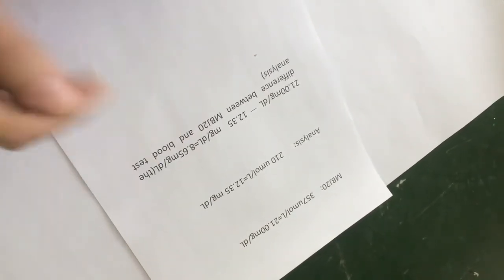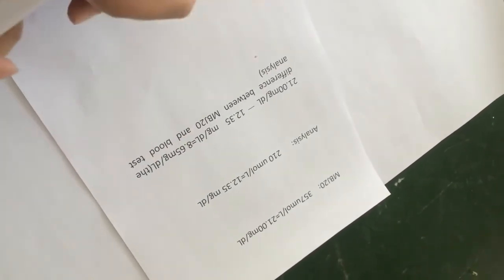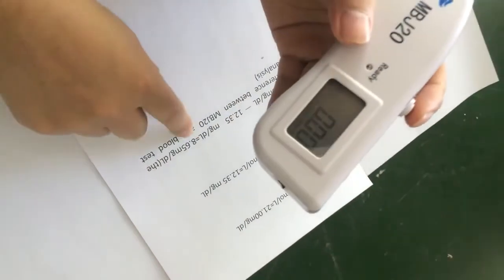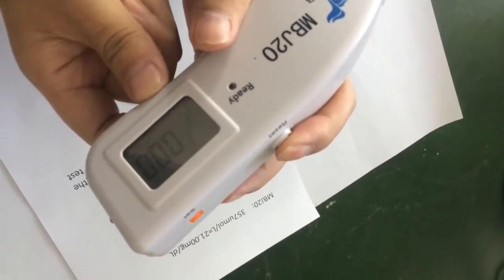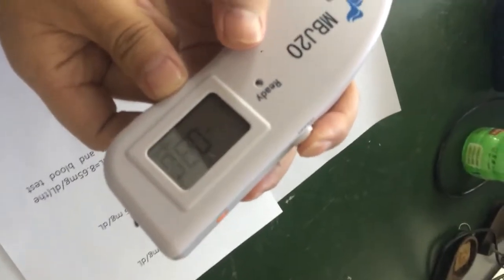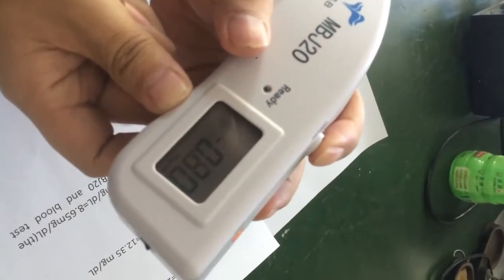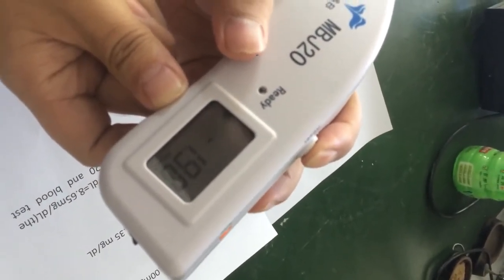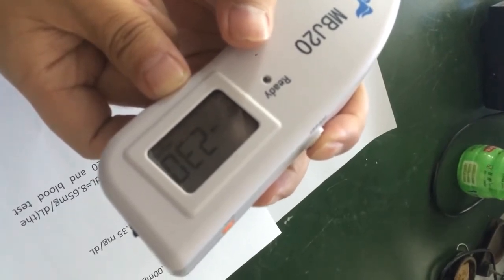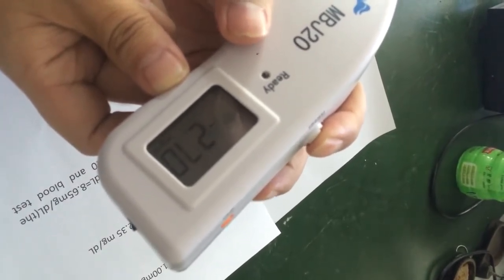This is the number we can work with. This number is higher, so we must reduce the number — reduce the difference. Press this button to reduce. So this is our numbers.